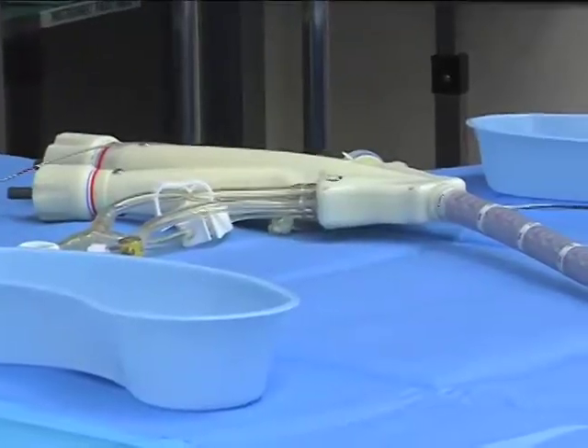This procedure is called the TOGA, which stands for transoral gastroplasty, and it's a new device and procedure that's been developed over probably six or eight years by a number of physicians and engineers as a way of achieving a gastroplasty through the mouth.